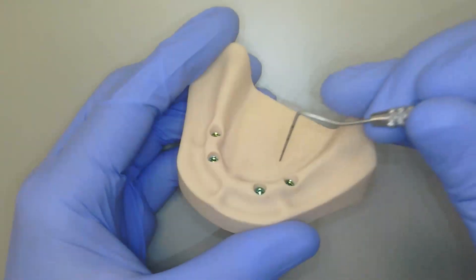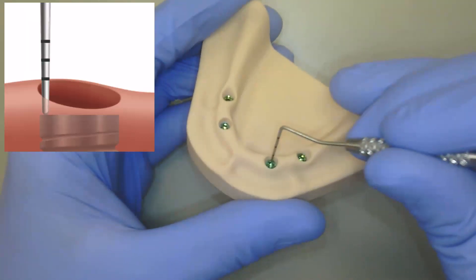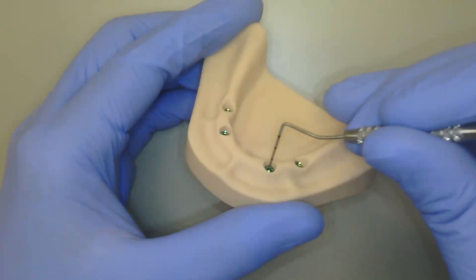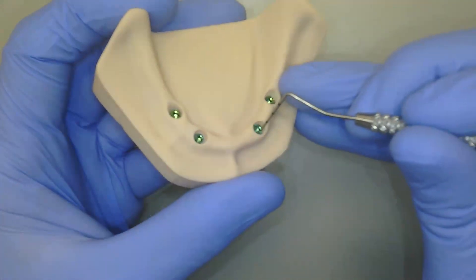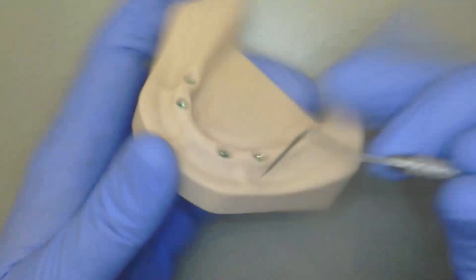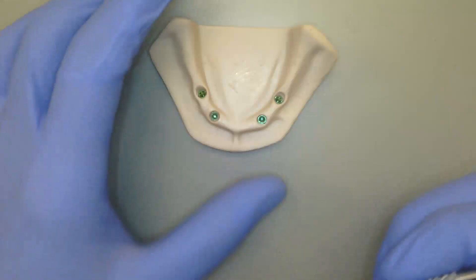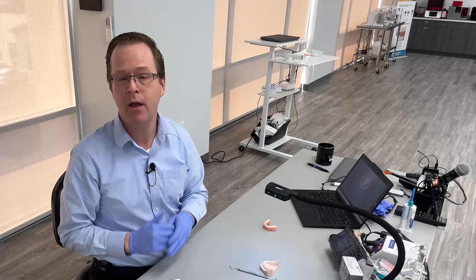This allows me to take my periodontal instrument and place it just at the edge of where my platform is for my implant, then read off the probing depth. Right in here is going to be two millimeters. On the facial, it's also two millimeters. As I jump to the distal, it goes up a little — I can see about 2.5 millimeters right there. And on the mesial, I've got 2.5 millimeters. So on implant number 22, I want to order a 2.5 millimeter locator abutment to match that soft tissue depth of 2.5.